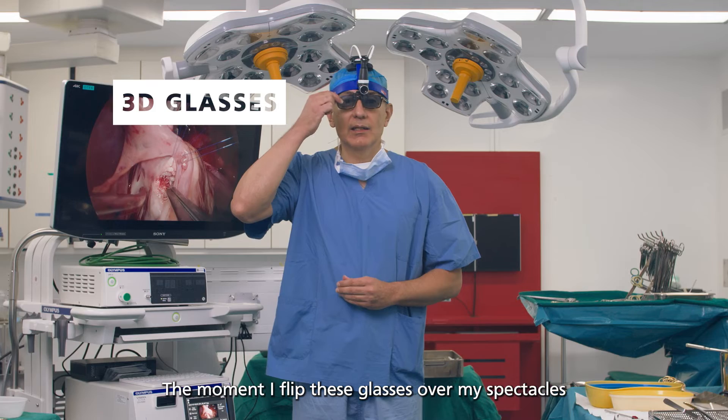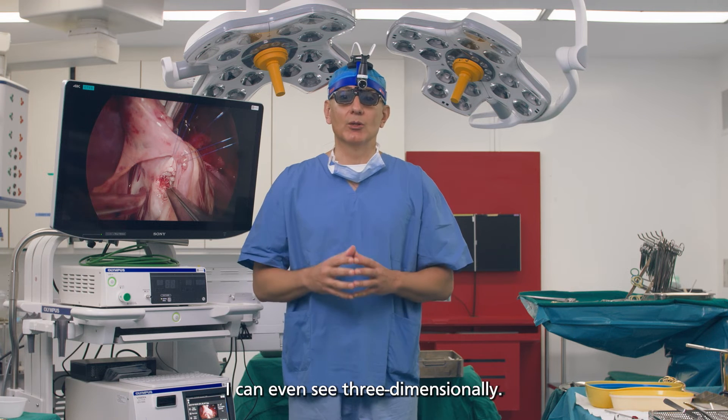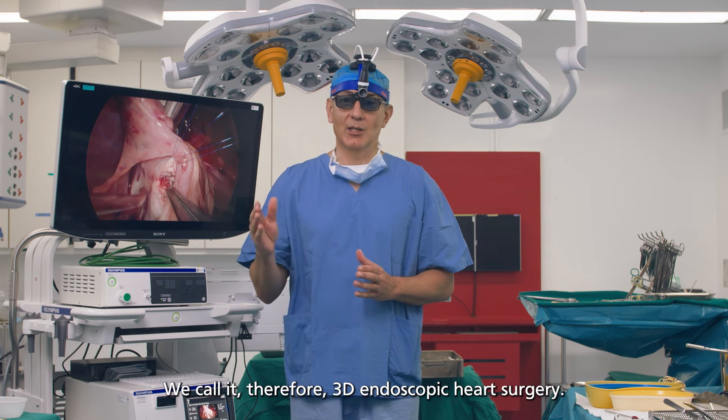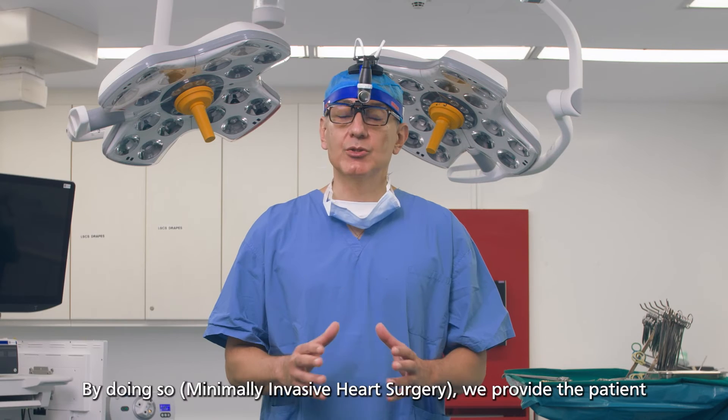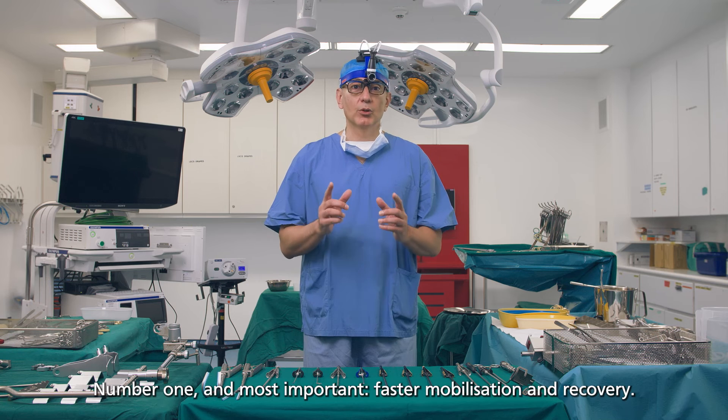The moment I flip these glasses over my spectacles, I can even see three-dimensionally. We call it, therefore, 3D endoscopic heart surgery. By doing so, we provide the patient with a lot of advantages. Number one, and most important: the faster mobilization and recovery.